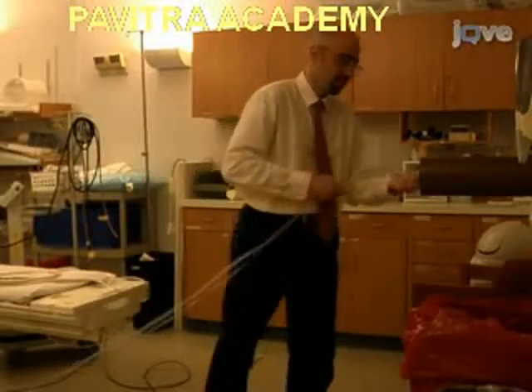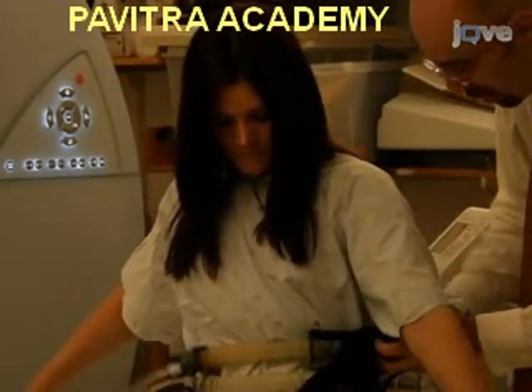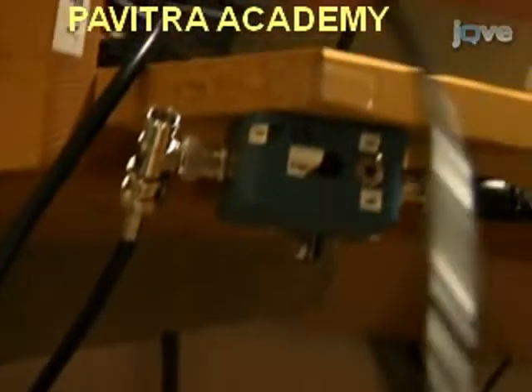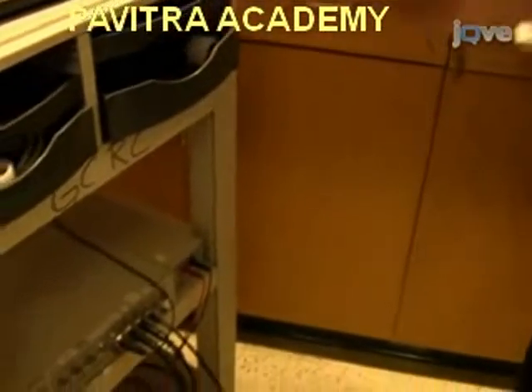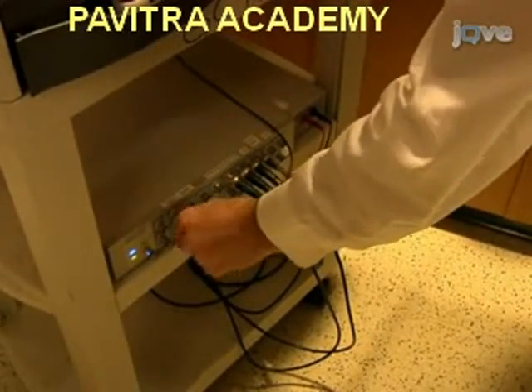To set up the respiratory belt system that is used to record respiration, plug the transducer into a power outlet in the scanner control room and feed the belt through the inlet into the scanner room. To synchronize the physiological data with the fMRI data, connect a BNC cable from the fMRI scanner trigger box to the PowerLab in the control room. The software can then be set up to start recording when a signal is received from the scanner.